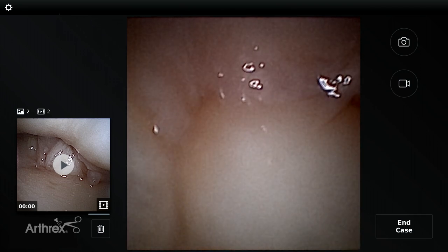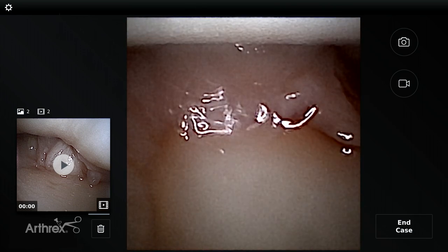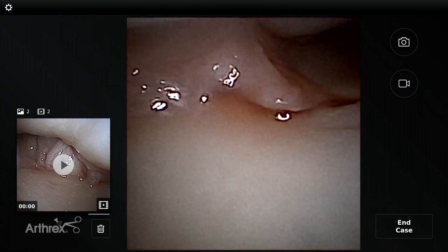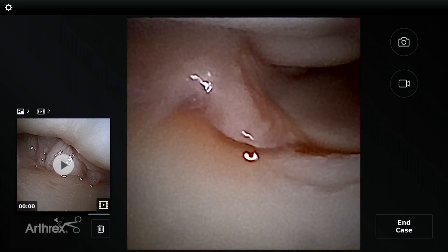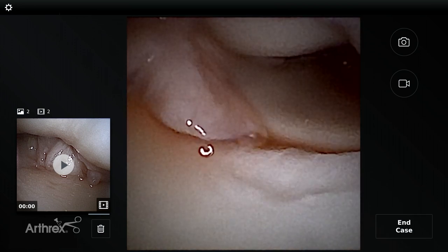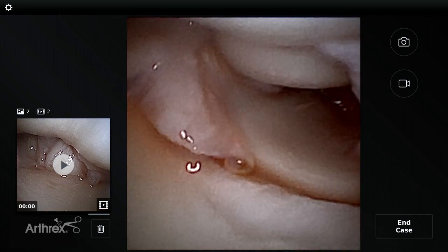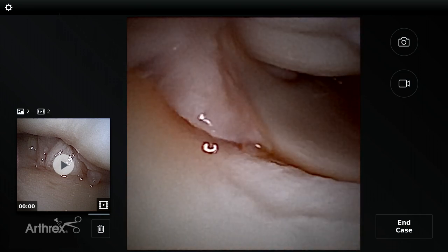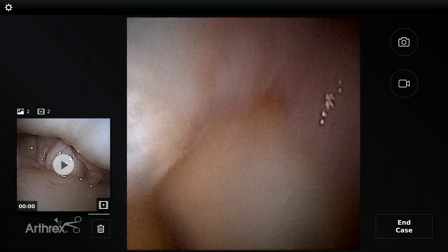As we come around and drop our hand, you can see we now have the capitate. Coming to the ulnar side, we follow the lunate and move to an area we haven't been yet — we're going to see the lunatotriquetral joint. Now you can see the triquetrum in the distance, and just above it is the hamate. You can see the capitohamate joint sitting right there, visualized with a 12-gauge needle you can even use in the clinic if needed.